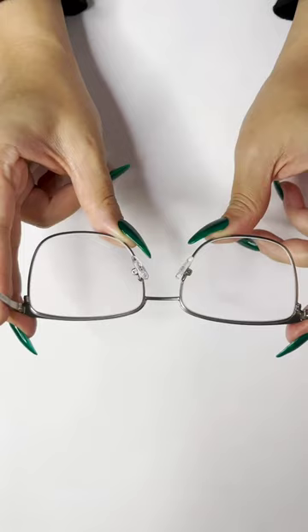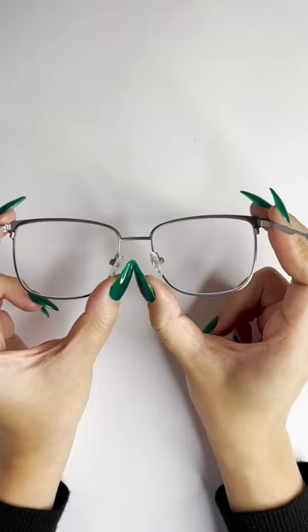Push your nose pads closer if your glasses sit too low. Push the nose pads apart if your glasses sit too high.